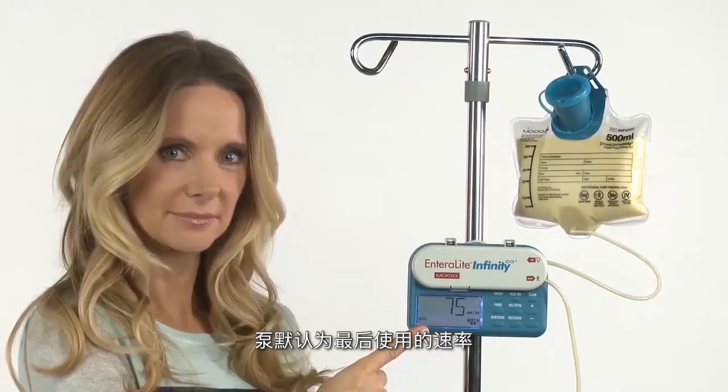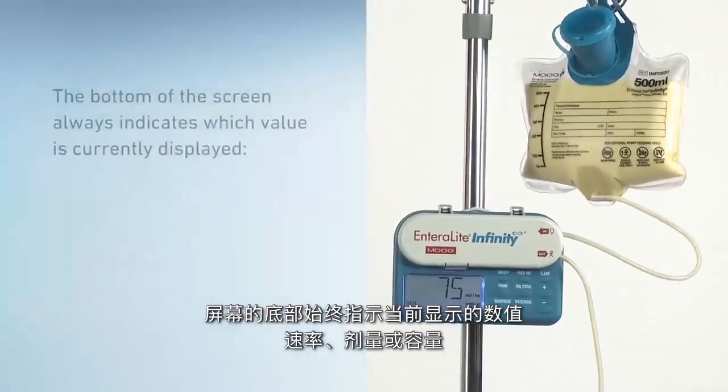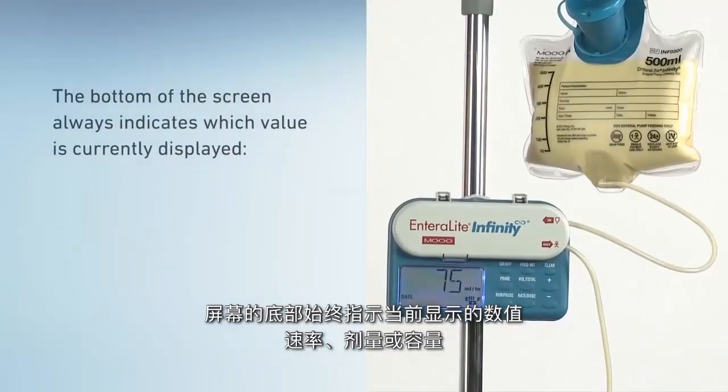The pump defaults to the last rate used. The bottom of the screen always indicates which value is currently displayed: rate, dose, or volume.